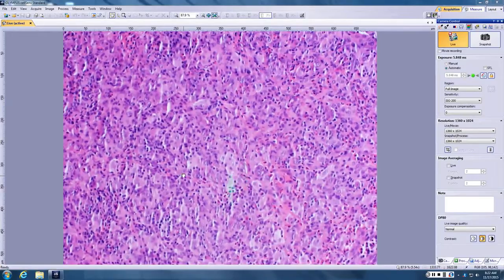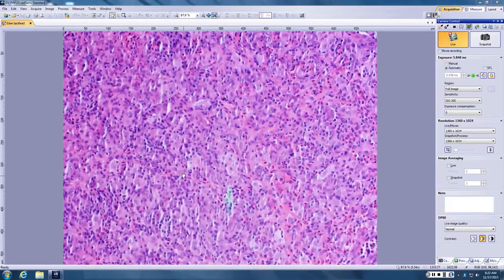But there's another hint here. There are so many nuclei sitting within the histiocyte cytoplasm. And are any of them pyknotic? Or are they all nice and gray instead of black? Gray. So they're all still viable. So they're not being engulfed or phagocytosed by the histiocytes and killed. They're just passing through the cytoplasm, which we call emperipolesis. So what histiocytic process has a polymorphous inflammatory infiltrate that tends to just wend its way through all that histiocytic cytoplasm?